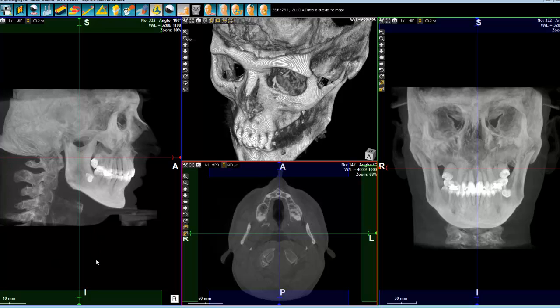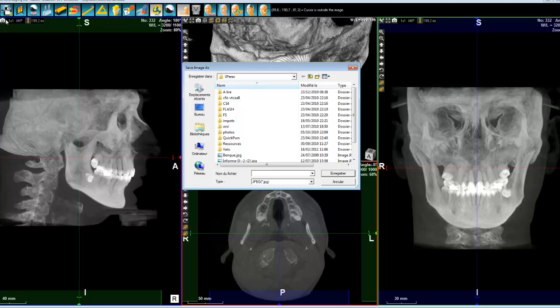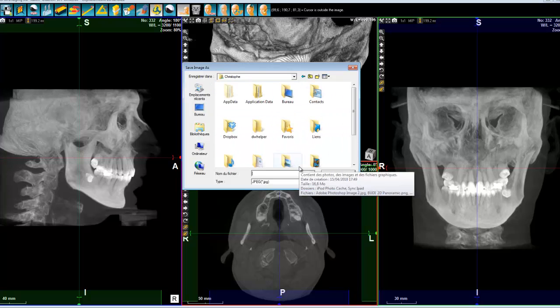If you want to export this image to your normal Orto software or auto calculation software, you simply need to click on this camera here, and then you can select exactly where you want to store it and in what format. JPEG is the best in terms of compression, meaning your image is going to be smaller in size, but Bitmap doesn't have any loss — though of course the image is much bigger.